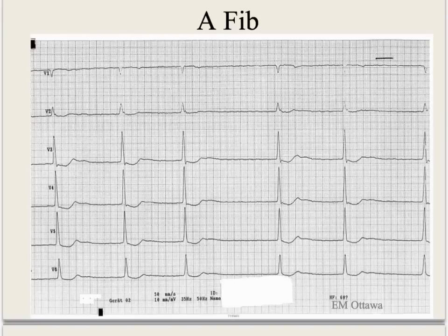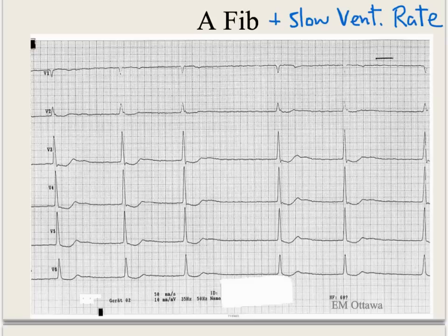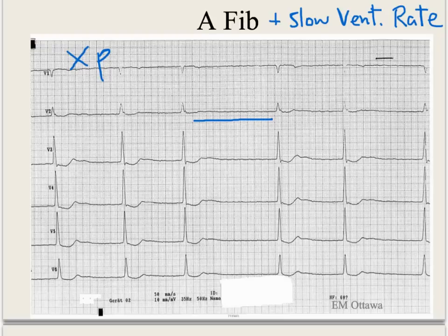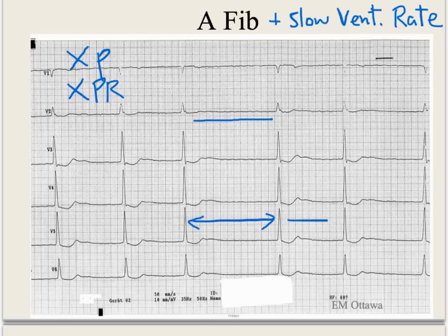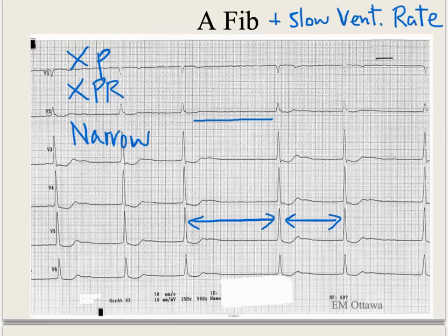This is atrial fibrillation with a slow ventricular response. You don't see P waves; however, you do see a bit of wavering at the baseline — that is caused from the depolarization of the atrial myocytes. So no P wave equals no PR interval and no relationship between P and QRS complexes. The RR intervals are not the same as each other, and the QRS complexes are narrow. Each QRS complex occurs when the impulse from the atrium gets transmitted through the AV node intermittently.